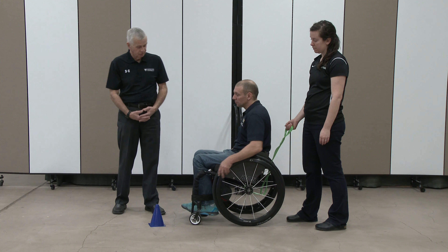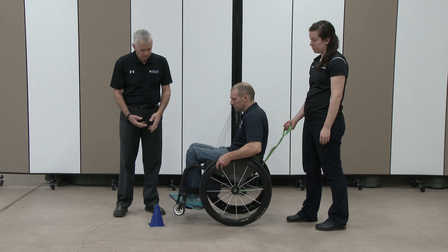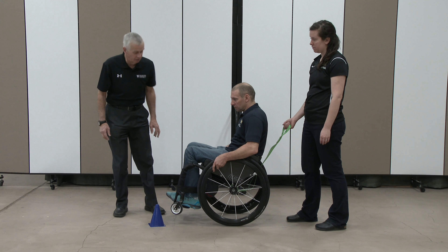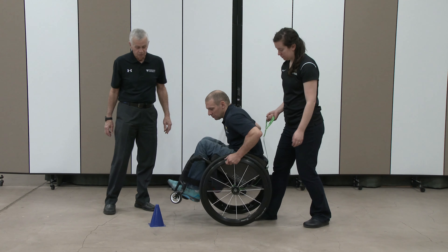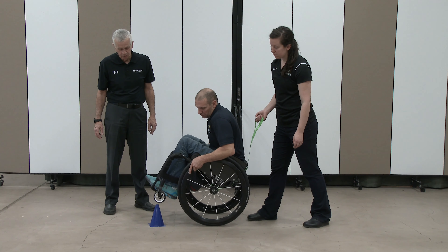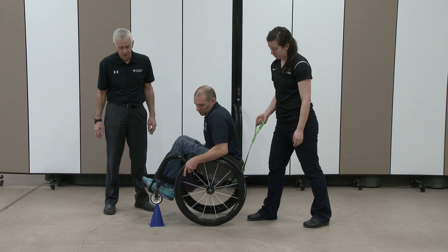So if Lee would just do a regular wheelie, you'll see his casters really don't come quite high enough to get up on top of the pylon. But if he leans forward, it allows him to get the casters higher, and then he can maneuver himself to the point where he can just tap down on top of that.